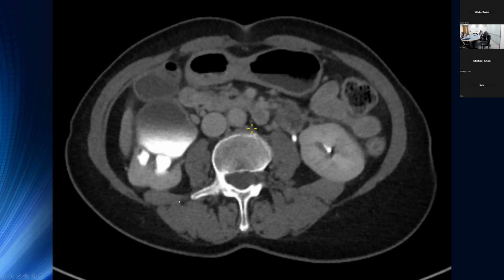And if you were to scroll further down, most of the ureter was non-opacified, but there was some layering contrast dependently in the at least proximal and mid portions of the ureter. So this is the type of case where ideally we wait a little bit longer and then repeat imaging with the patient in prone to allow that contrast to dump anteriorly and get a nice visualization of the contour of the urothelium in the anterior portion of that dilated renal collecting system.